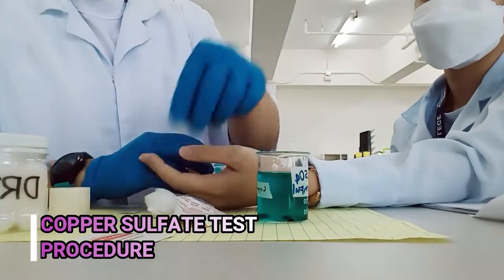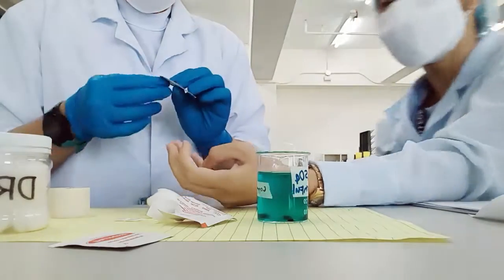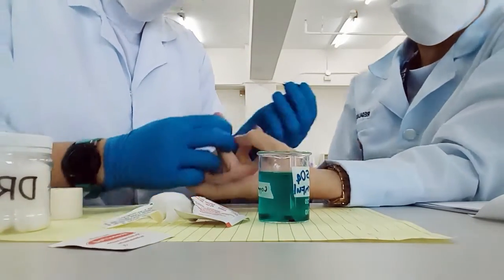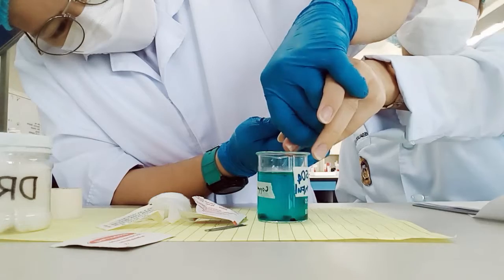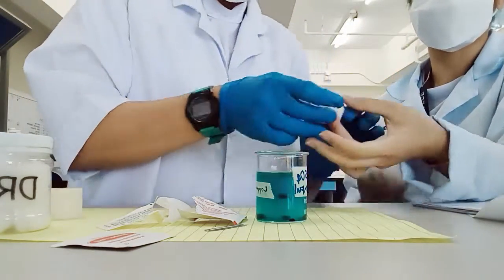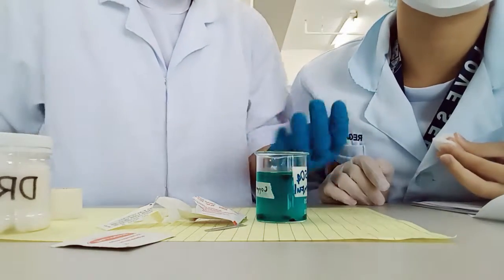Copper sulfate test procedure. Prick the finger and let the blood flow out. Allow a droplet of blood to fall on the copper sulfate solution. Then observe the movement of the droplet. If the blood floats, then the donor is deferred, but if it's not, then the donor is allowed to donate.